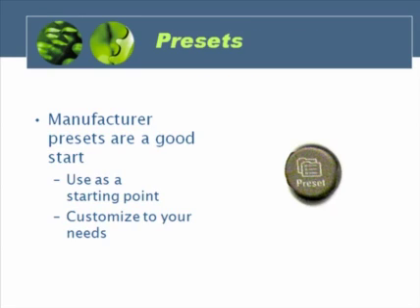Manufacturers are very good in giving us presets. Remember that the presets are a good start, but that should not be where it ends. You should customize these presets to suit your needs because what the manufacturer thinks is a good image may not meet your definition of a good image, and you want it to be pleasing to your eye and to be diagnostically accurate as well. So use the presets, but be sure to optimize from there.